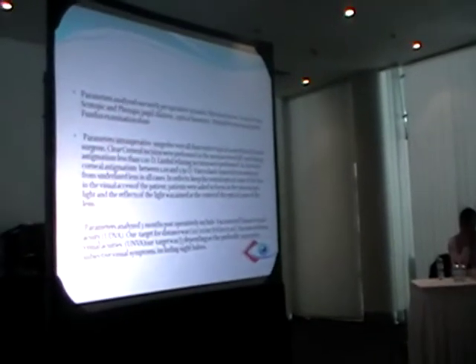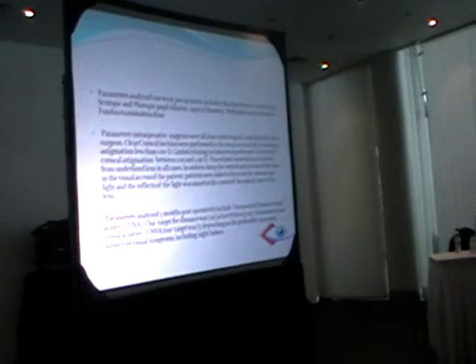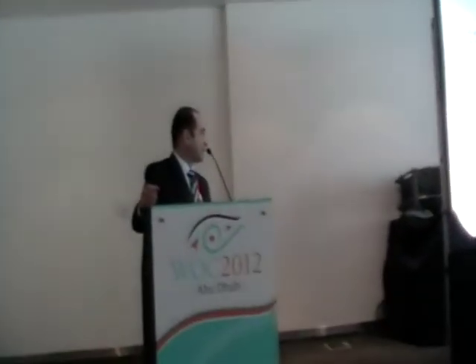Limbal relaxing incisions were performed in eyes with a corneal astigmatism between 1 and 1.5 diopters. Viscoelastic material: I'm using sodium hyaluronate with low molecular weight and high molecular weight, so it's working as a cohesive and dispersive. But in all these surgeries, I removed all the viscoelastic from under the lens to make sure of the stability of this lens.